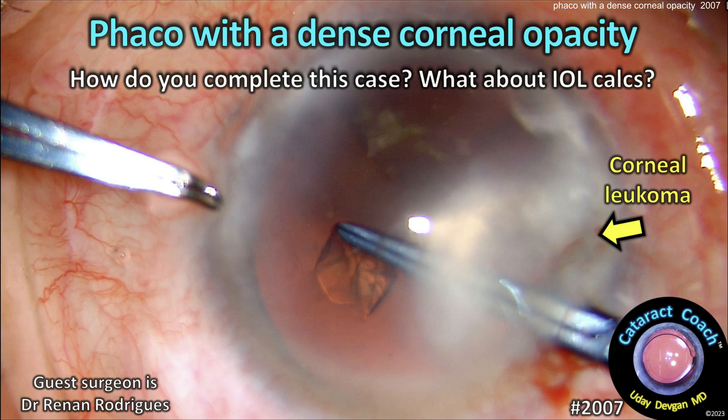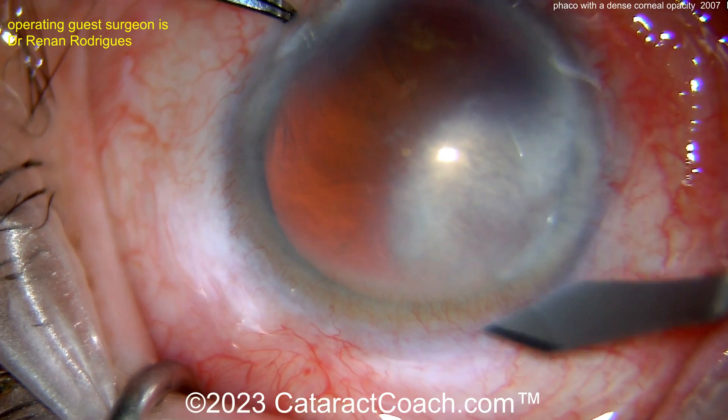CataractCoach.com. Phaco with a dense corneal opacity. How do you complete this case? What about the IOL calculations? Let's watch.